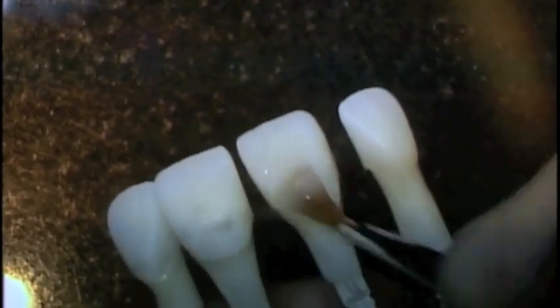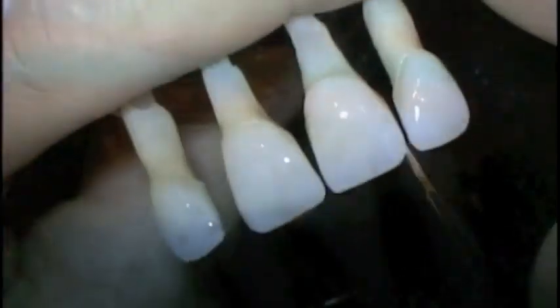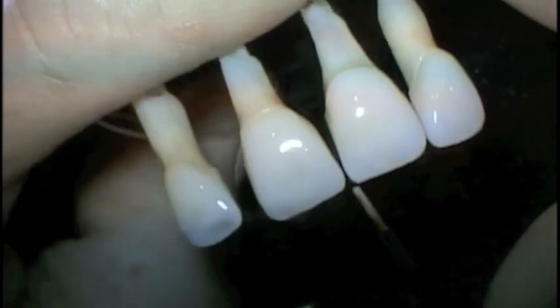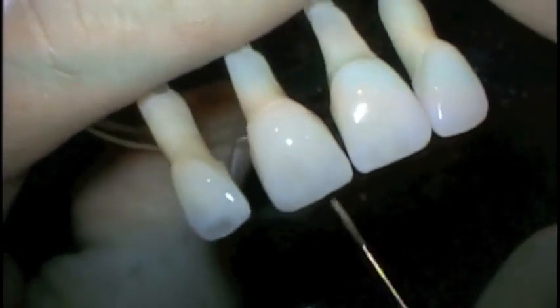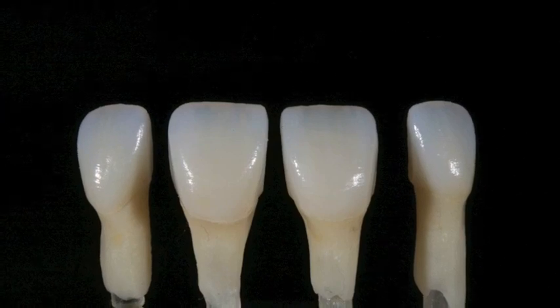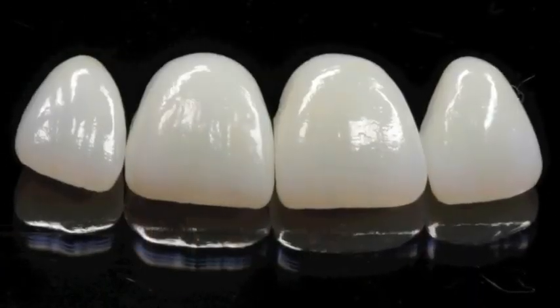I'll go ahead and apply my glaze layer after I've fired all my stains. It goes in the oven, comes back out. Now we're doing a glaze layer. And I'll apply a little bit of white halo effect with a white stain in the glaze. I don't do that when I'm staining. I want to keep it separate. Here's our final result of how the restorations look on the composite dies.